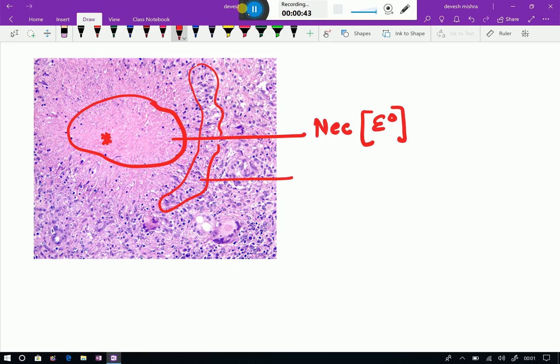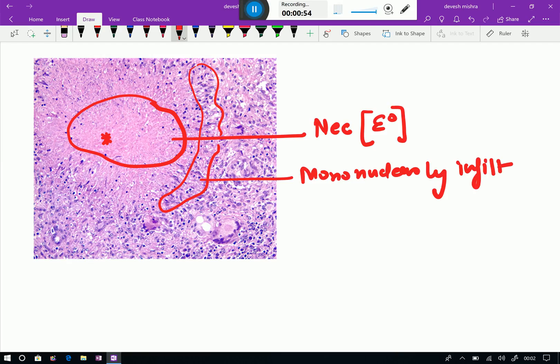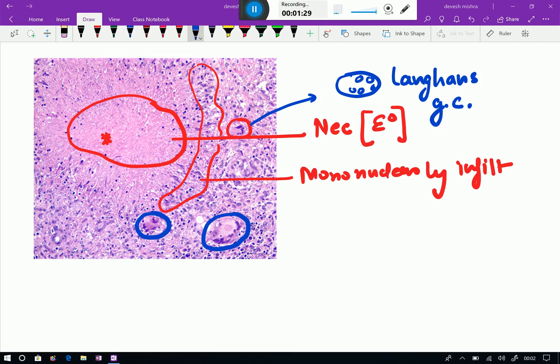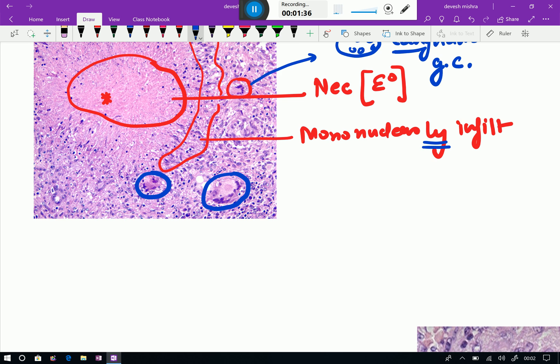These are all mononuclear lymphocytic infiltrate. If you look at this cell which I have encircled, you can identify there is a small cell and the nucleus is at the periphery — these are Langhans giant cells. Similarly, you can notice here also one Langhans giant cell, and one more Langhans giant cell. So you can see a perfect definition of the granuloma where we see necrosis, followed by the mononuclear lymphocytic infiltrate, and Langhans giant cells with peripheral or horseshoe-shaped arrangement of nuclei.